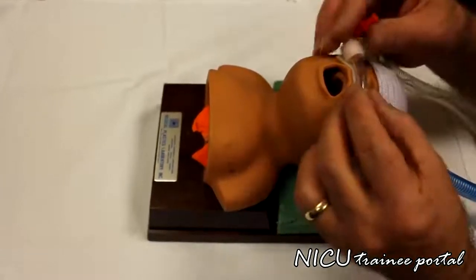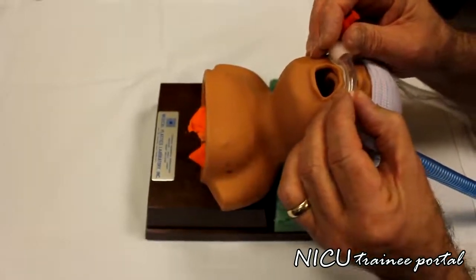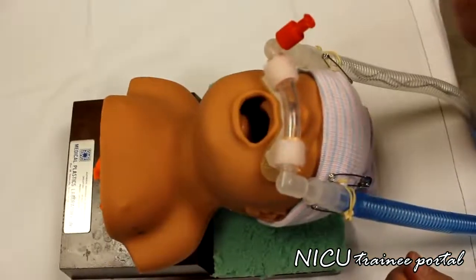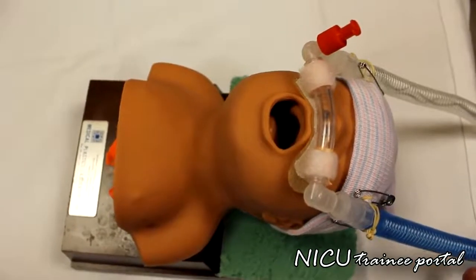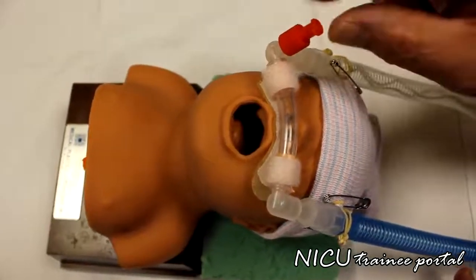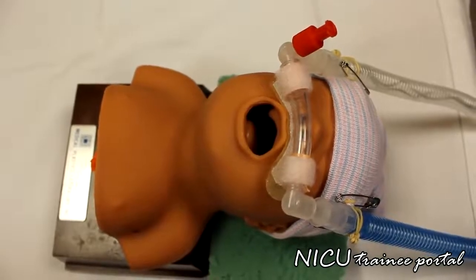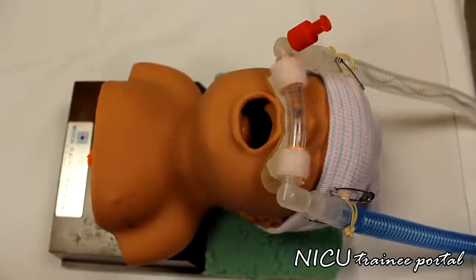You don't want the prongs buried onto the nares. You want a little bit of an airspace. We call it a cushion. They're also available in the NICU, a little foam piece that fits in between the prongs and the nose. So that's basically it. We also put it on a monitor, so we monitor the pressure in centimeters of water pressure. Typically the range is anywhere from 5 all the way to 7.